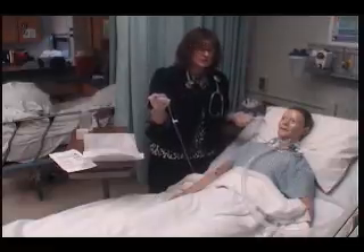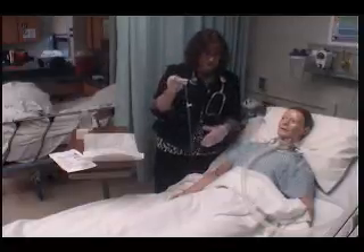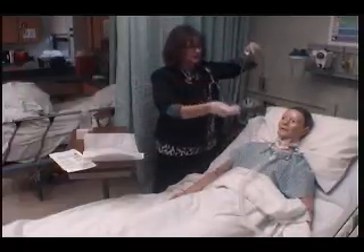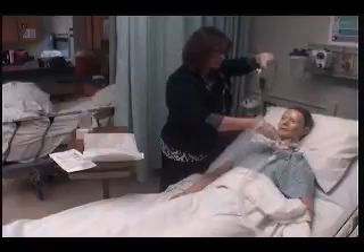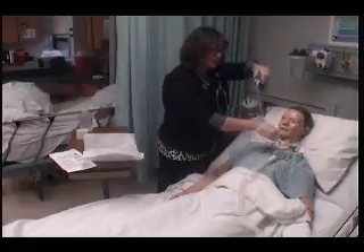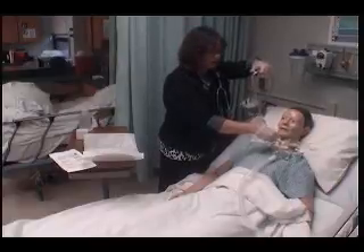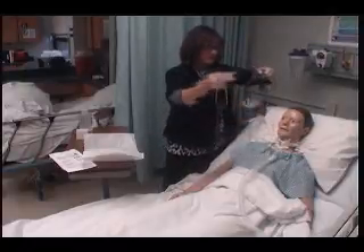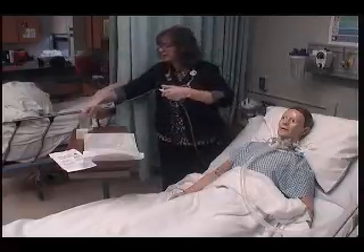So I'm going to suction for the second time. Take a deep breath, sir — I want him to hyperoxygenate beforehand. I've already cleaned my suction catheter. I pull the trach collar away again, keeping myself sterile, and get ready to put the suction catheter in and go down. Notice how my hand is positioned so that I remain sterile. I get the carina, pull back a little bit, then intermittent suction while twirling the catheter on the way out, keeping good control. I give his oxygen back and then clean the catheter.